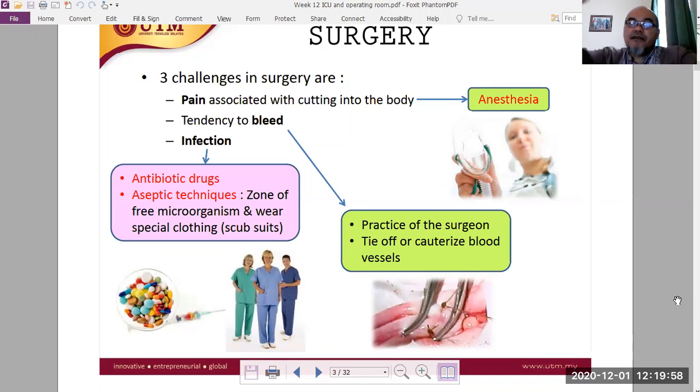Through the console, the robotic hands conduct the surgery, while the surgeon is like operating a game, and doing precise surgery. Future trends related to surgery may still be science fiction: future surgery will be conducted by micro or nano robots, swallowed or injected into the bloodstream, and then going to the particular place where the surgery is needed.